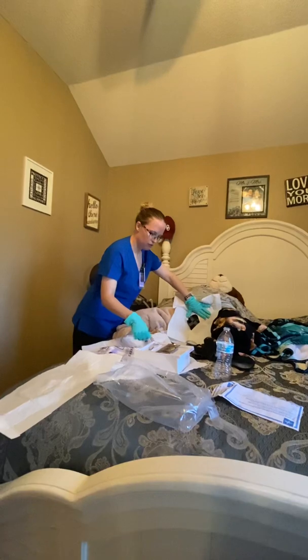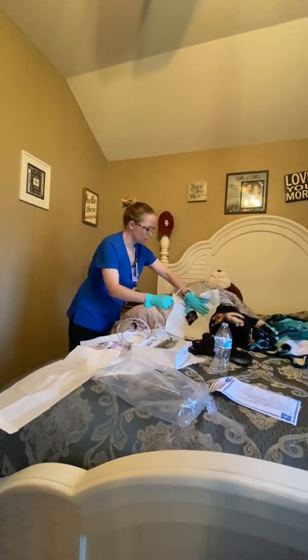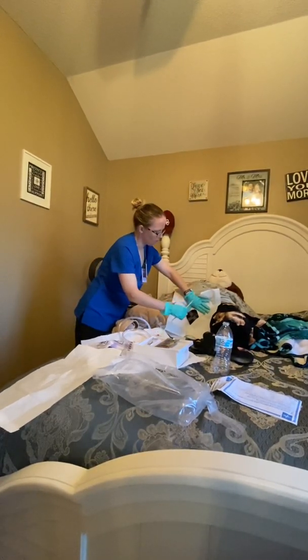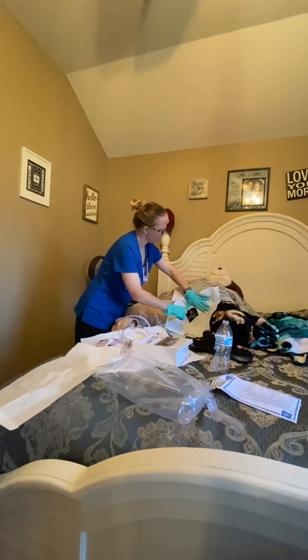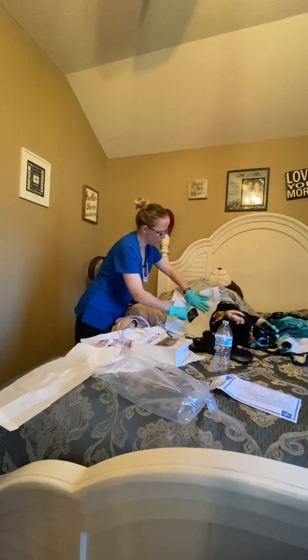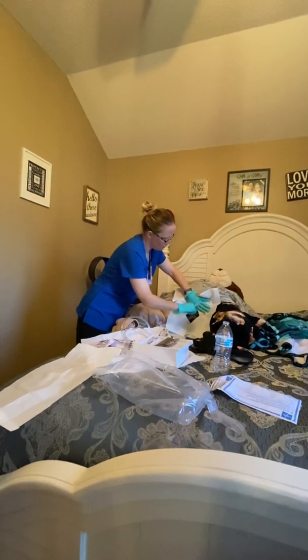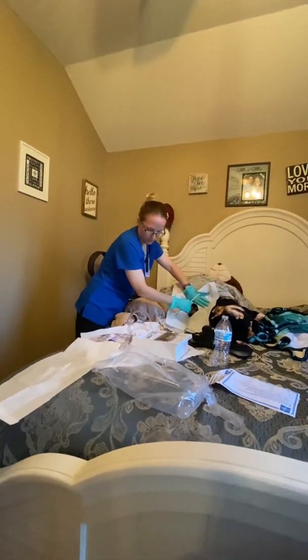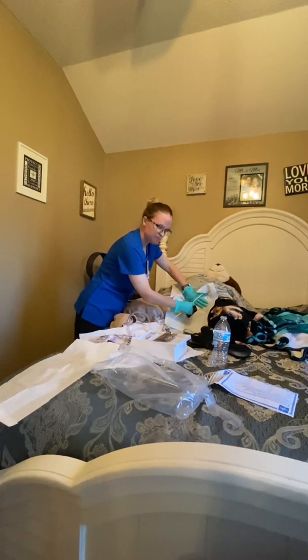Going to grasp it about 2-3 inches below the tip of the catheter. We're going to ask the patient, "Can you take a deep breath in for me?" And then once you exhale, I need you to act like you're making a bowel movement, and we're going to insert it through the urinary meatus. Once we insert it, we're going to look for urine to go into the catheter. Once we see urine in the catheter, we're going to slide it in just a little bit more.